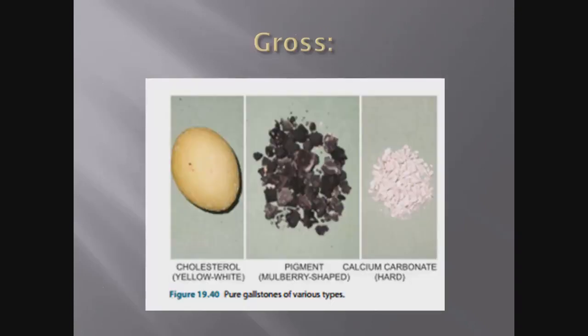Here is the picture of the gallstones, the pure type of gallstones. You can see the cholesterol, pigmented and calcium carbonate stones.